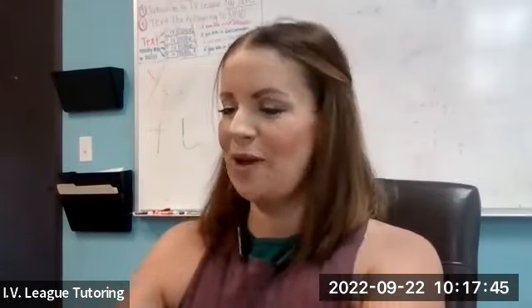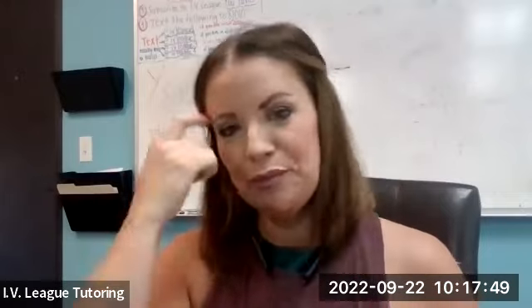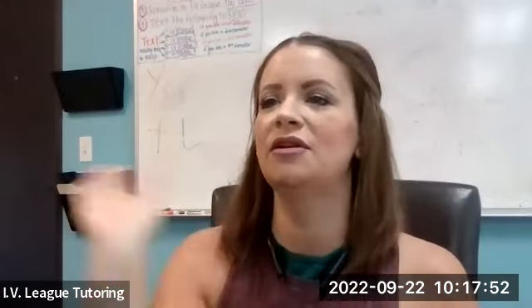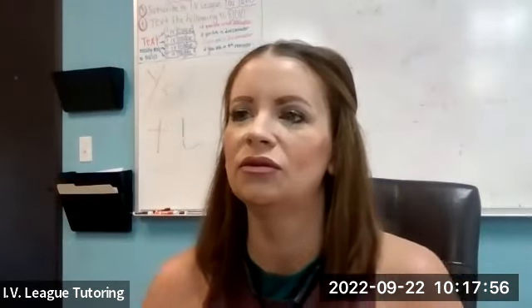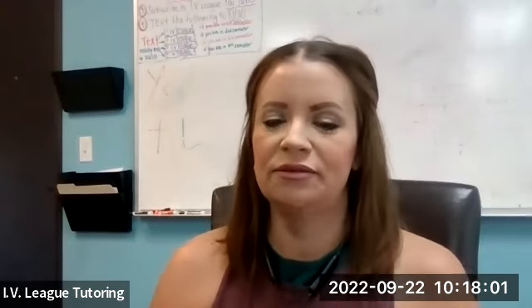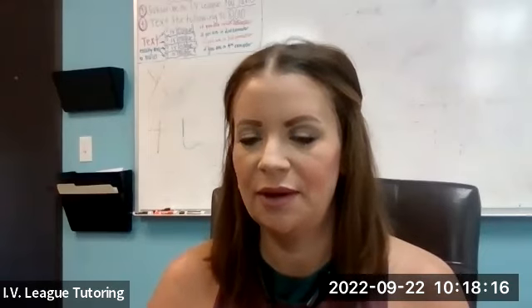Okay, so we're going to go back to the basics, Juana. So what's a normal heart rate? Don't look at your papers, turn them over. You've got nothing. Okay, so we've got 60 to 100. Do you know what a PRI is? Is it something interval? Yes, it's a PR interval. So it's from the P to the R. Okay, that was easy enough. 0.12 to 0.20, that is where we will live today. What's a PRI? I just asked you. PR interval, and what's a normal PRI? 0.12 to 0.2. Okay, yeah.